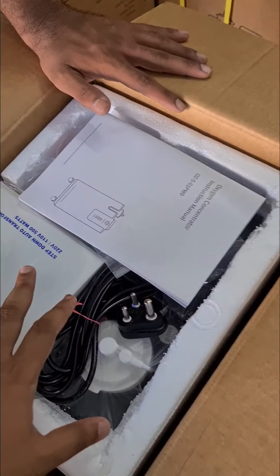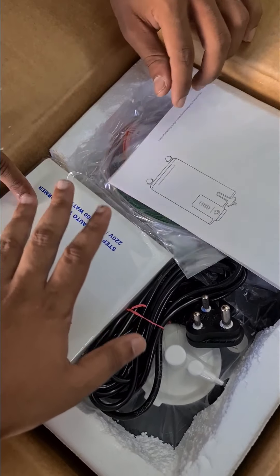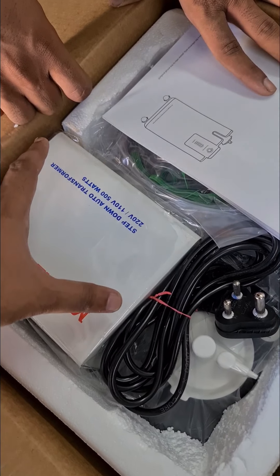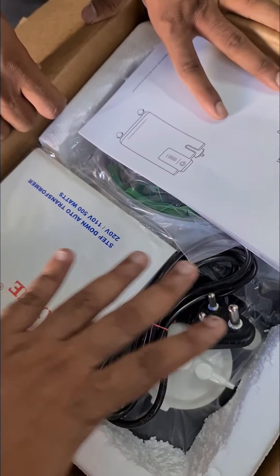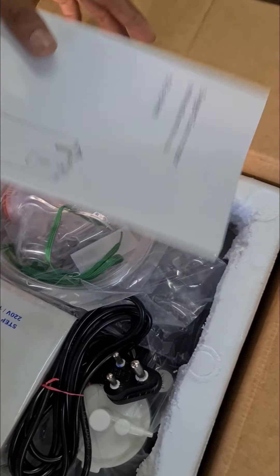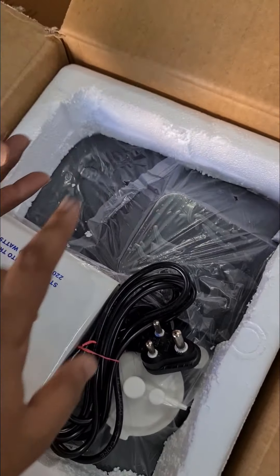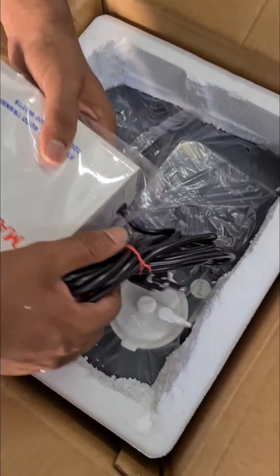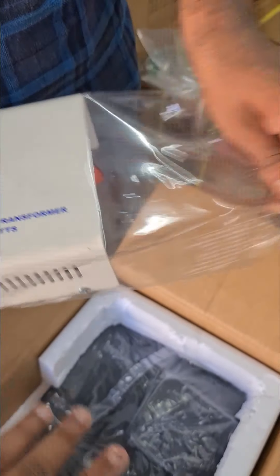We have already modified and kept the transformer for you. As all of you might be aware, this machine was actually designed for the US and Mexican market, so you have to always use this only with the step-down transformer. You need not purchase anything separately — we have included everything in the package. So this is the user manual, keep it aside. One nebulizer kit. One nasal prongs, which is going to be connected to the patient for oxygen. And now the step-down transformer. Always remember, without this you should not connect this equipment.